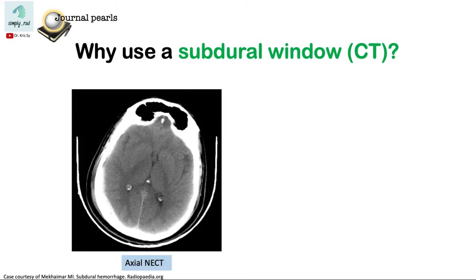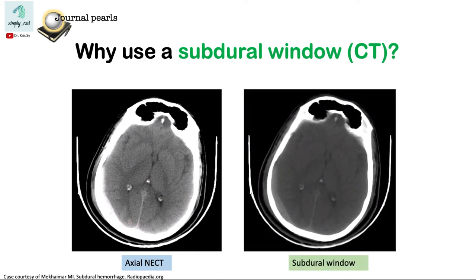So why do we use a subdural window? So this is an example of an image in the brain window. In this region, this is something suspicious. Switching to the subdural window, now we are more convinced that there is something going on here.